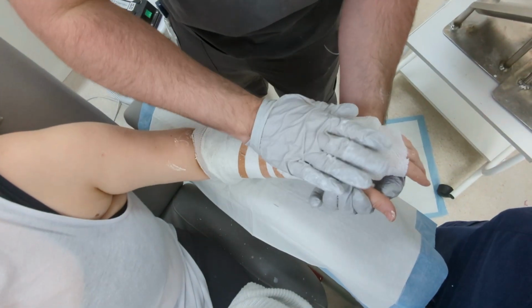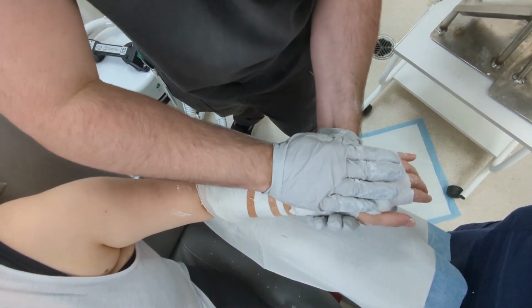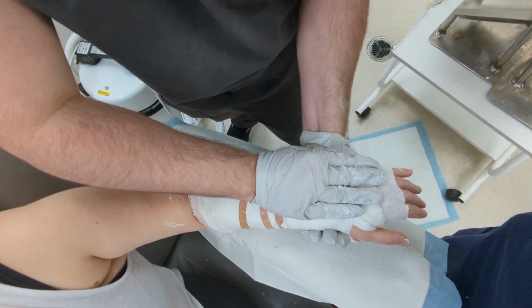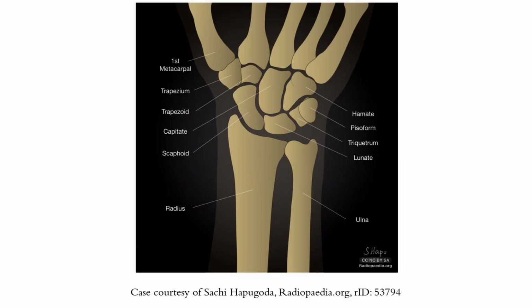When treating wrist fractures, the position of the wrist and the cast is very important. This describes wrist flexion, extension, as well as deviation. When determining the position of the wrist post-casting for treating fractures, it is important to consider the fracture and the anatomy involved, in particular the radius, ulnar, and radial carpal joints, including the scaphoid and lunate.